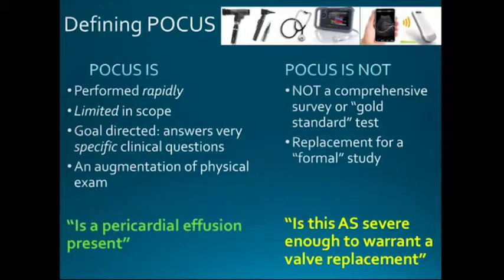And lung ultrasound, I think, is a great example of what we call point-of-care ultrasound. Point-of-care ultrasound is pushing a lot of the frontier about what we traditionally use ultrasound for and really expanding it. We're getting more and more people exposed to smaller, more portable devices, and the applications are really expanding beyond what we would normally consider standard ultrasound. But one key difference is that it's always going to be performed rapidly. A point-of-care ultrasound exam is not like a 30-minute test. It's 5 minutes, less than 10 minutes is typically the benchmark that we use. It's got to be integrated as part of your bedside evaluation.